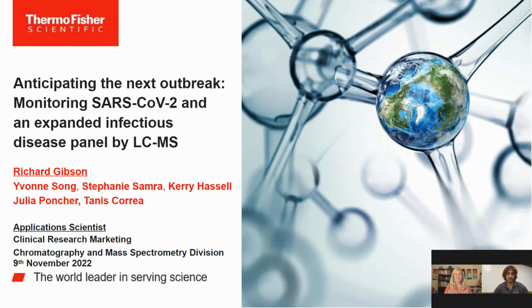Thank you so much. And we have another one coming in from our audience. Why can't we just rely on PCR testing during future pandemics? PCR testing is great and it's very efficient. It works fine. But there were times during the last COVID pandemic, towards the start of the pandemic, when people weren't really prepared for it. There was a shortage of reagents, so we need other testing methods that use different reagents that can easily be developed and used when we can't do PCR.